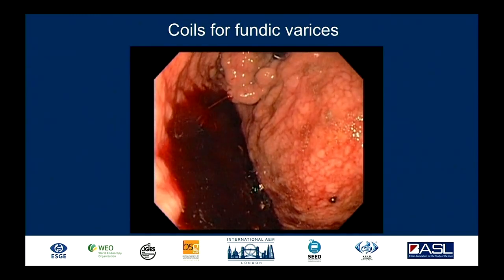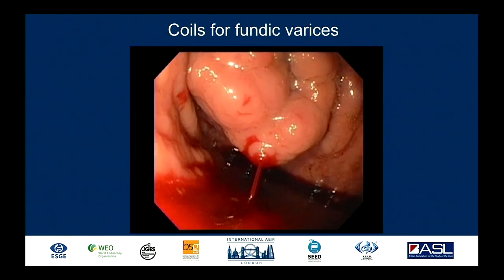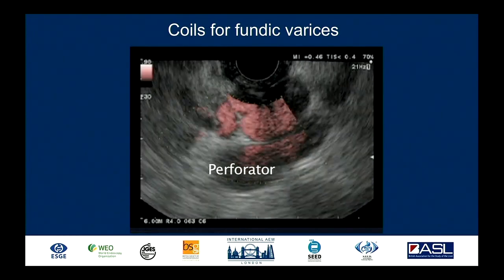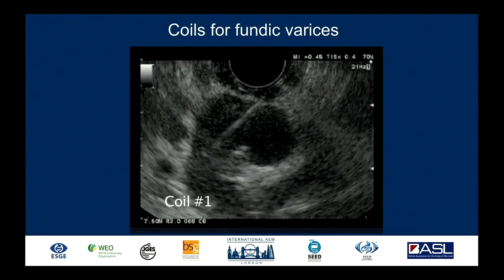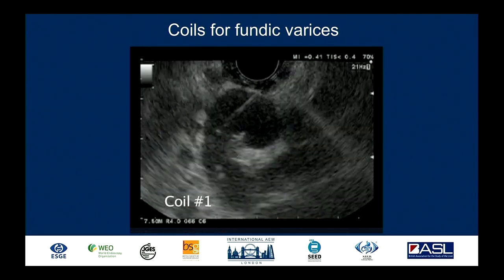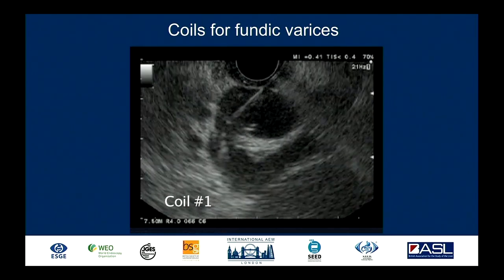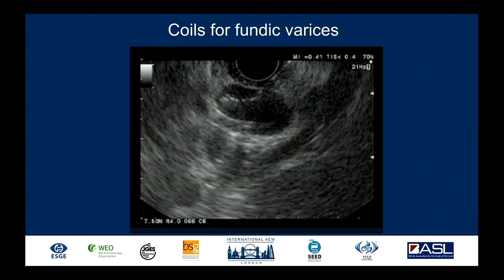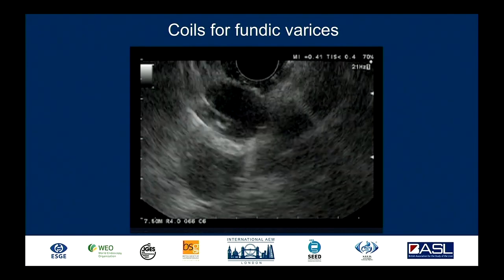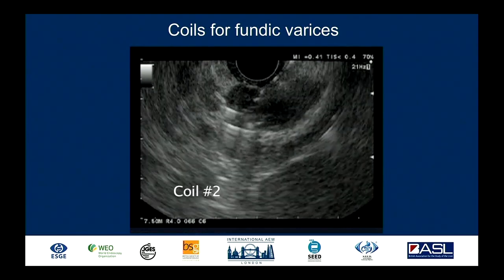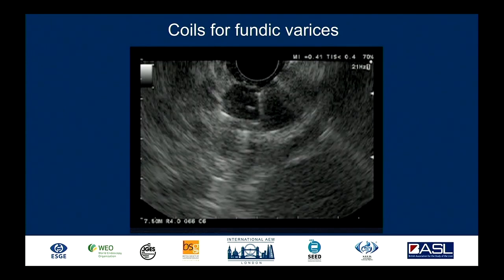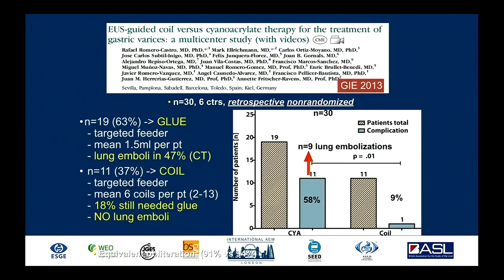In this video you can see a bleeding gastric varix. Instead of endoscopic injection of cyanoacrylate or EUS-guided glue targeting the feeder vessel, we're placing coils. This is the feeder vessel connecting the collaterals on the outside with the varices on the inside. We push the coil — which is very nicely echogenic — into the varix, watching it unravel inside. We'll place whatever number of coils are necessary to obliterate the lumen.